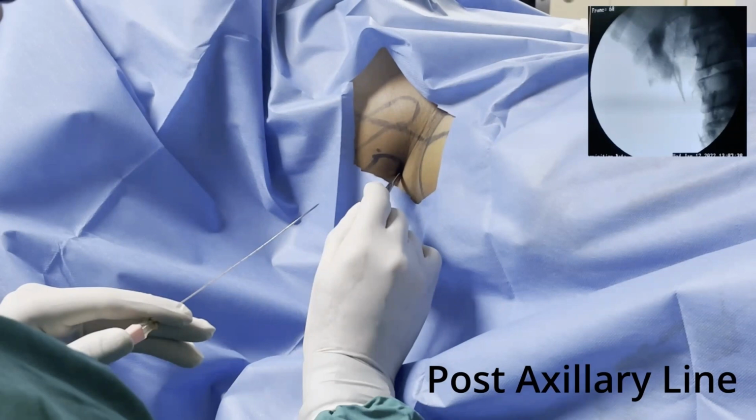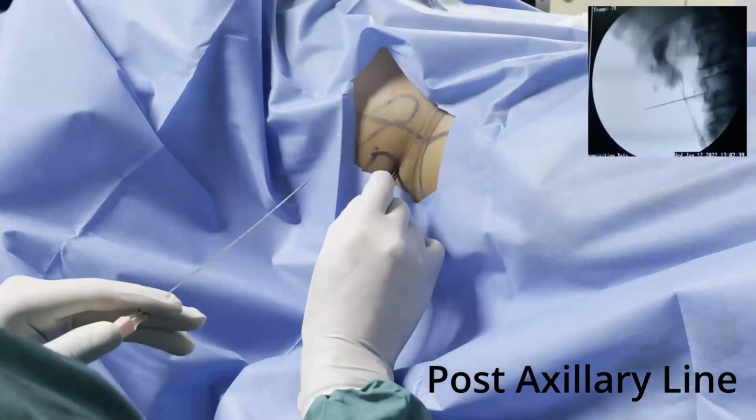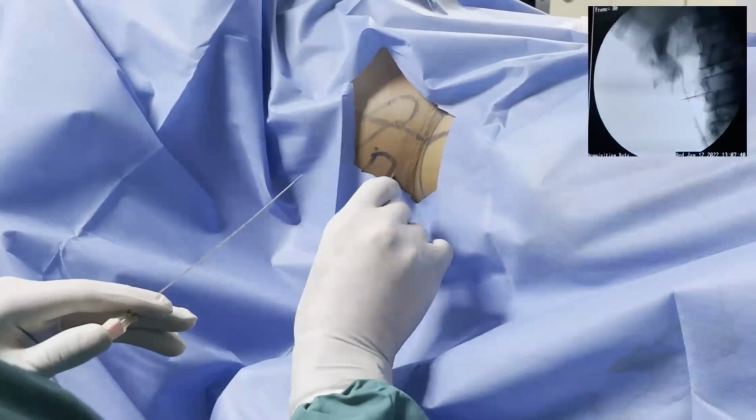After selecting, as the stone was in the pelvis, in this patient a lower calyx puncture would be a better option rather than going supracostal. Even we can go supracostal also. Puncture can be easily done even in supine position. So here the stone was found in the pelvis, so we went ahead with the puncture in the lower calyx.